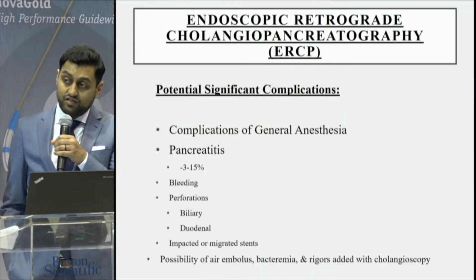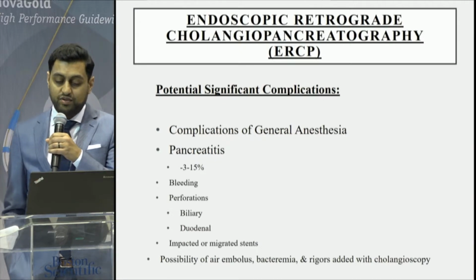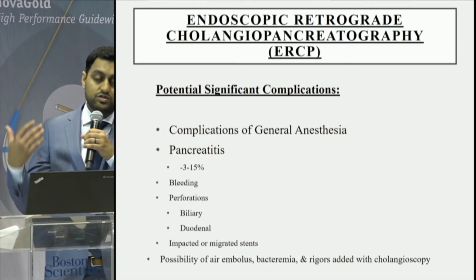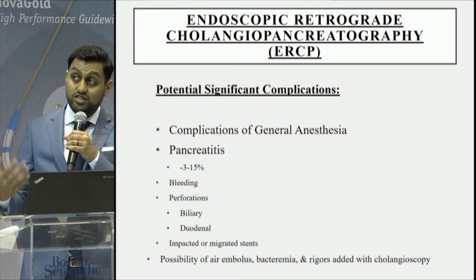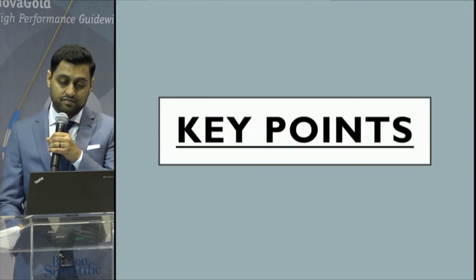A little bit back about ERCP. The addition of cholangioscopy has not given us a significant rise overall in the amount of complications that we typically see from ERCP. But there is the possibility of translocating some bacteria. So when we use this technique, we actually try not to over distend the bile duct with too much water. We have a combination of water with suction so that the bile duct doesn't get over distended and they don't get some translocation of bacteria.